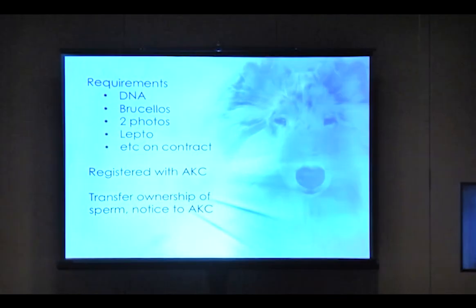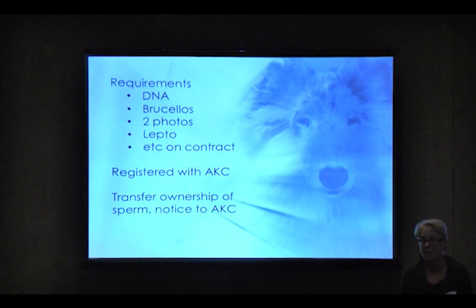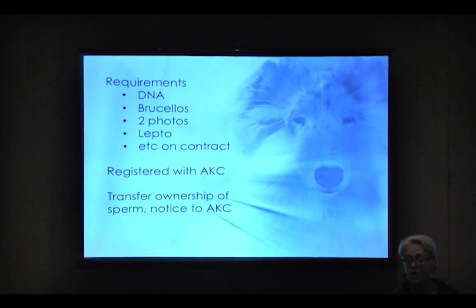Can you do a test freeze and thaw? Absolutely, before it goes into the tank. After we freeze the semen, we take out one pellet and we thaw it and see what the viability is. That is actually how you get your true number of sperm, because you consider your total number of live sperm after the thaw. Because a lot of dogs don't freeze. Any idea why? Well, I think that's where we're playing with the different extenders. As long as we play with the different extenders, we're going to find something that works.